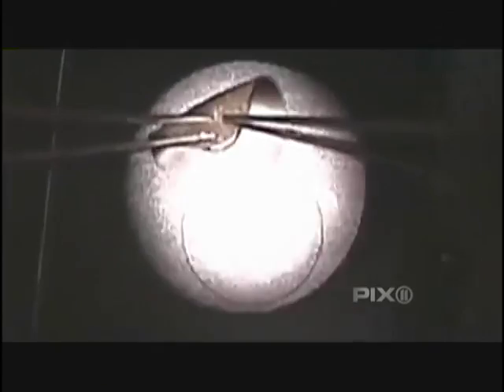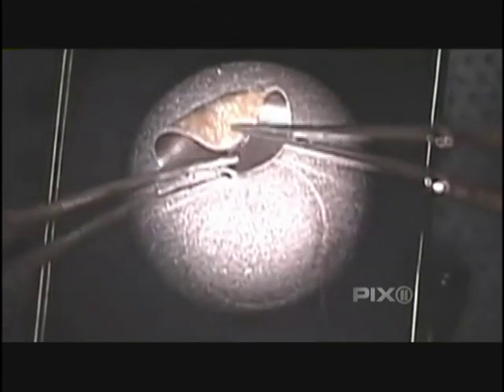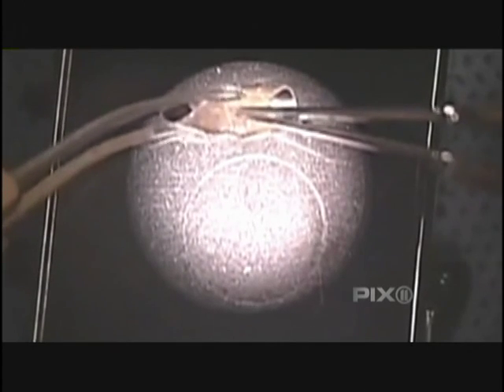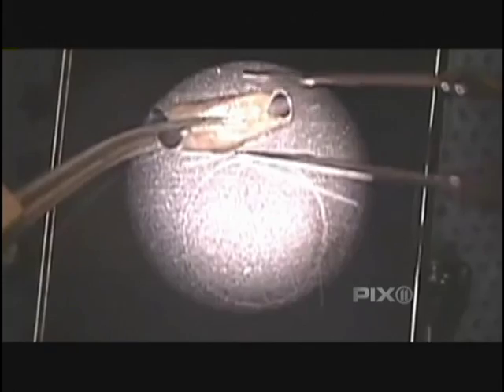And you can see that this is made out of soft silicone. And if you look carefully, you see it has little folds, little rugae on the surface of the device, just like the natural iris. If you look at it, it has all these little nooks and crannies. And so this looks very natural. We fold this so that we can insert it through a very small opening. This is just a cartridge that we put it in.